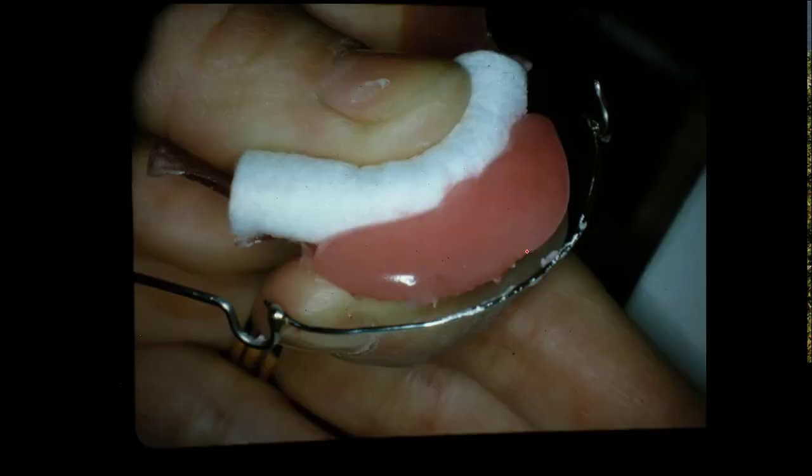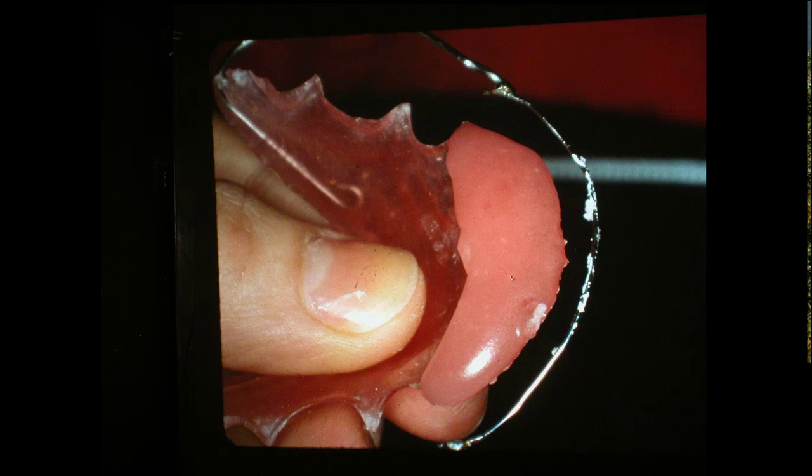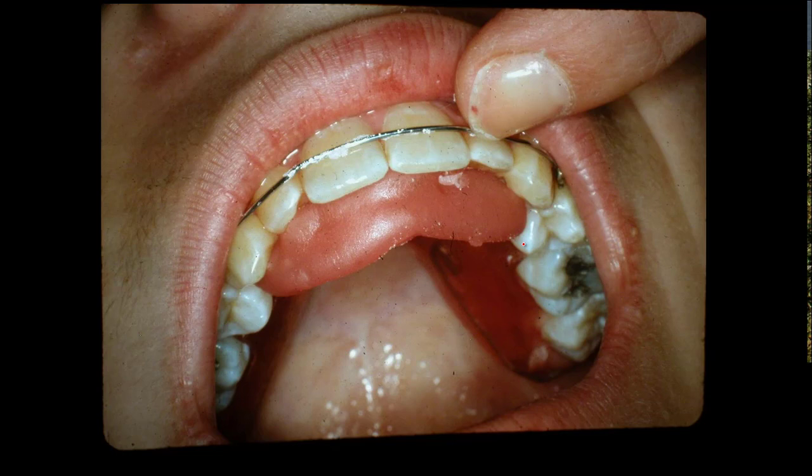Once you get the material on the front of the retainer, you've held your thumb in there with the cotton and it begins to set a little bit. None of this acrylic has gone under to get on the tissue side of your retainer. Making a bite plate is not a simple thing to do — you have to do it right. Now we take the cotton away and we've got this acrylic that is still soft. We insert this retainer into the person's mouth, making sure that the retainer is all the way up in the mouth. You put this in and take your finger and push it — the retainer's got to be seated firmly. Then you take your finger and kind of mold this acrylic up around the anterior teeth.